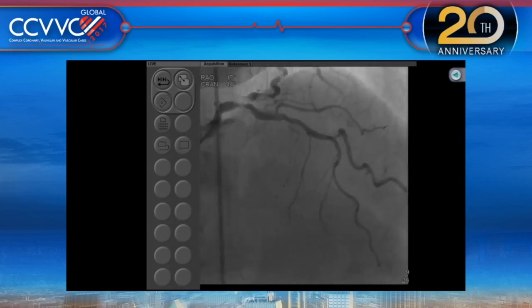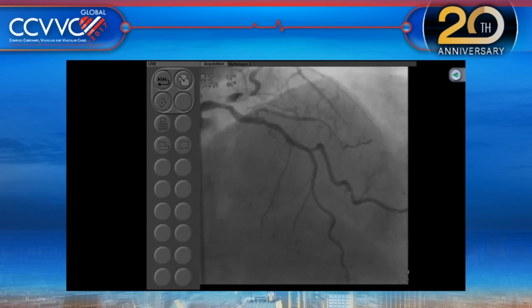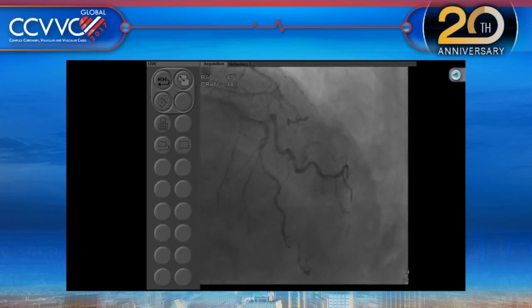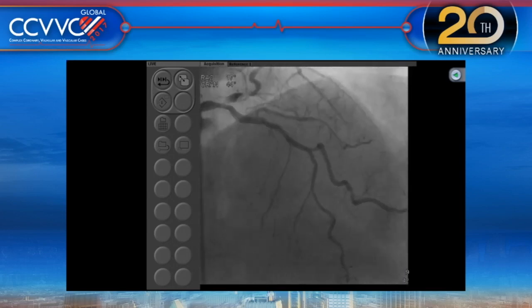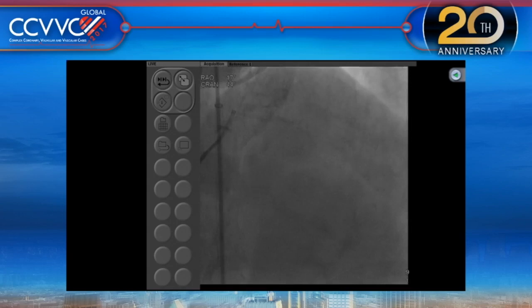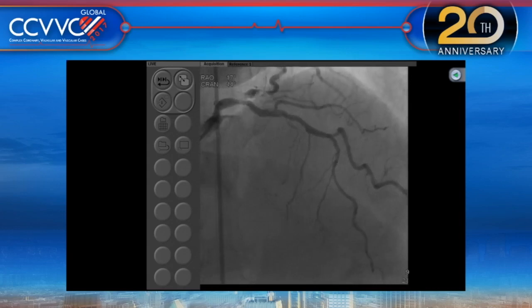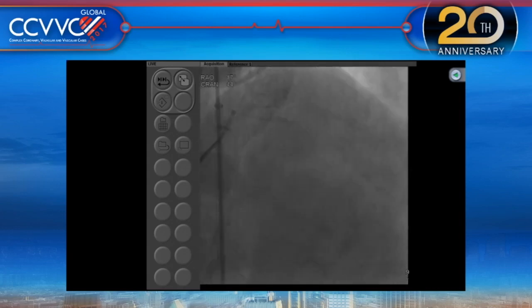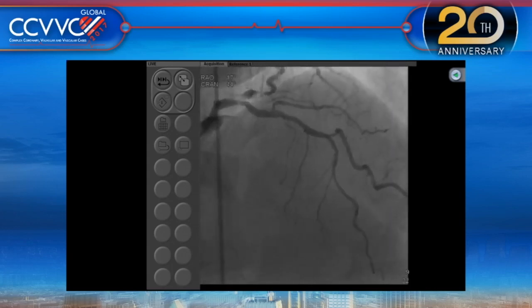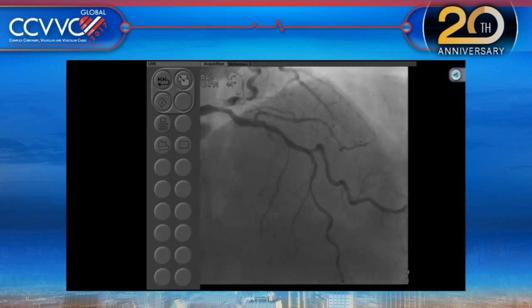So in the last case, before you go, John Fox said, how about doing some hybrid revascularization? If your patient is refusing bypass, I know we're going to undertake the hybrid protocol here at Mount Sinai, which is an NIH approved protocol with John Pluskis and Anatine Jellins. But what do you think? Is this a good patient for that? Is that something you might even consider, doing a Lima to this LAD or a hybrid operation, or do you think you're going to be able to take care of all of this in one go around of a PCI?